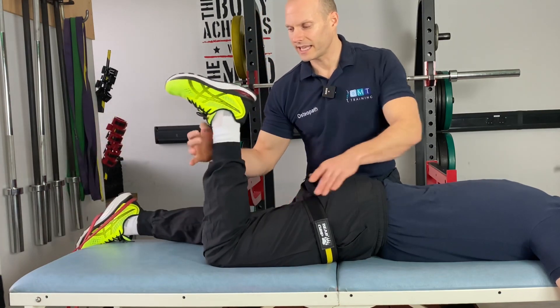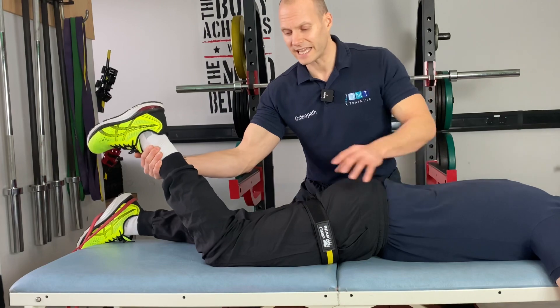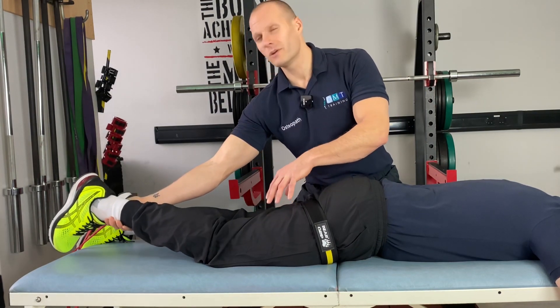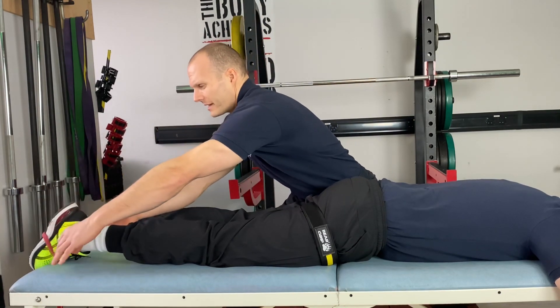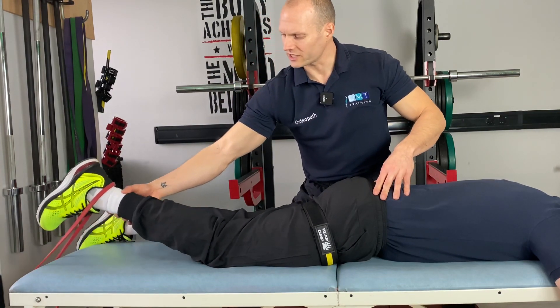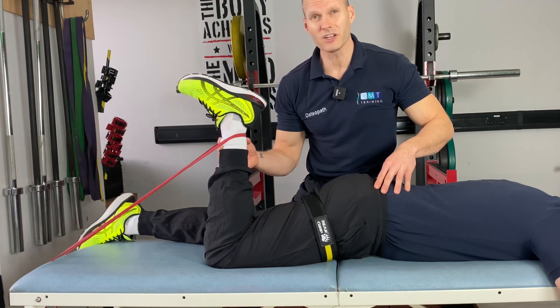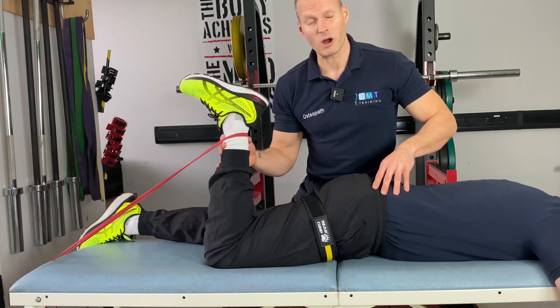As he lowers down, we resist, resist, resist — creating that tension and time under tension of the hamstring. We could also add an element of theraband here by placing a theraband behind the patient's foot, which allows us to add even more tension. As the patient comes up, we start to load the hamstring under control and keep the tension up.